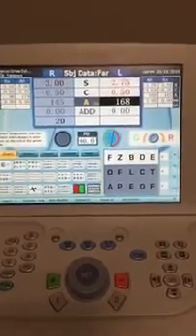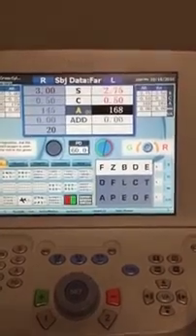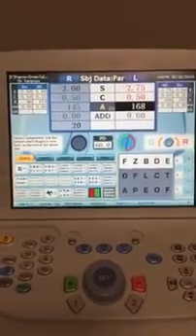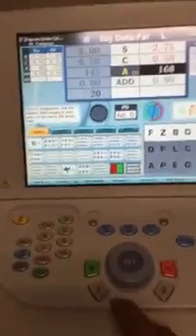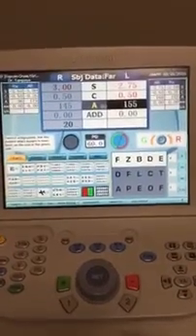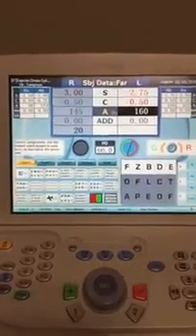and it's gonna go down to the axis. Now, since there is already a -0.50 cylinder, I don't screen for cylinder on the major axis here. So right now, what I'm gonna do is go straight to the axis refinement. And so I ask them which side is clearer, right green or left red. And then they say left red, so I'll press it 3 times for 15 degrees, and then they say green, then I come back 10, and then they say red, go back to the right once for 5.